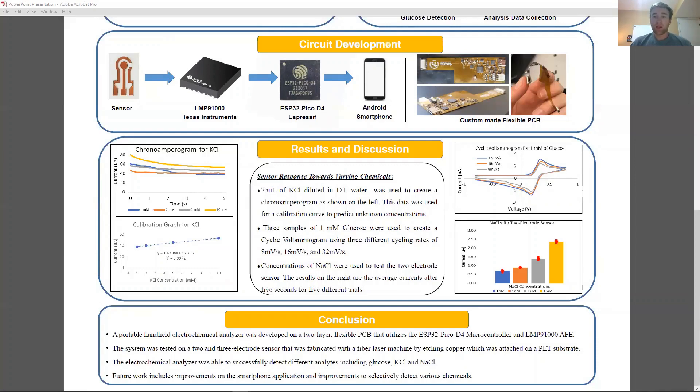The PCB is connected to a 3.7-volt lithium polymer battery and has a built-in battery monitoring and charging circuit by connecting a USB-C cable. There are three LEDs on the board, used to show low battery, wireless communication, and what mode is selected. The sensor connects to the board through a ZIF connector, which is located away from the rest of the electronics.